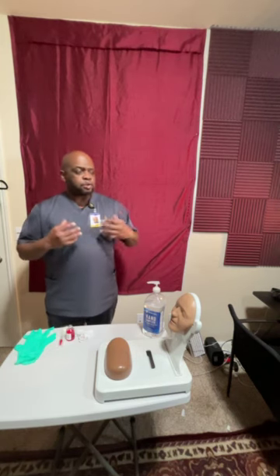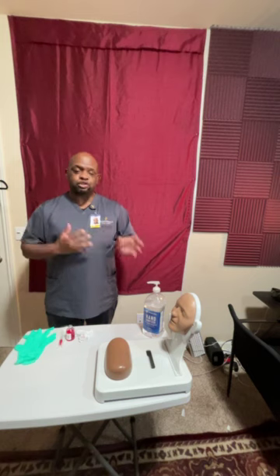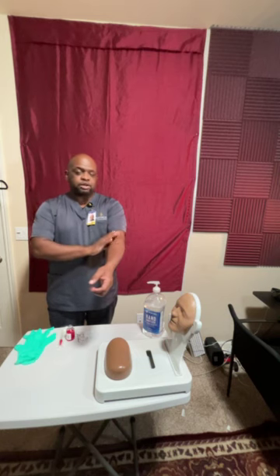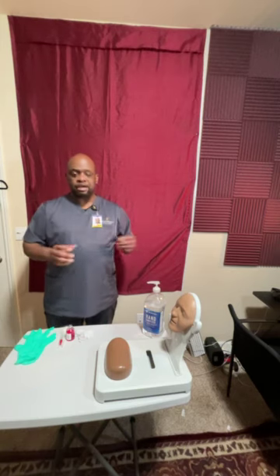From there, I'm going to also instruct Mr. Jones that although the skin may feel irritated or itchy, please do not scratch the area. I'm going to ask Mr. Jones to avoid the area. In fact, not to even rub on it. Don't press on it or anything like that, because we want that bubble to be intact. That medication needs to do what it needs to do up under that skin for 72 hours.